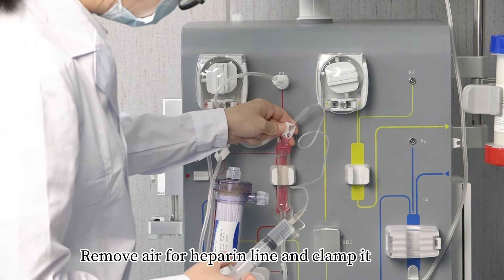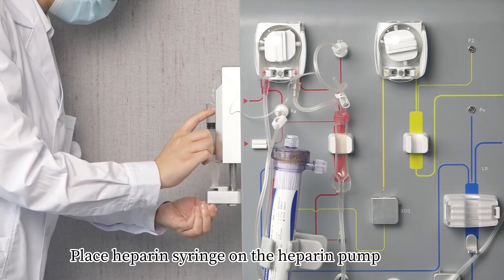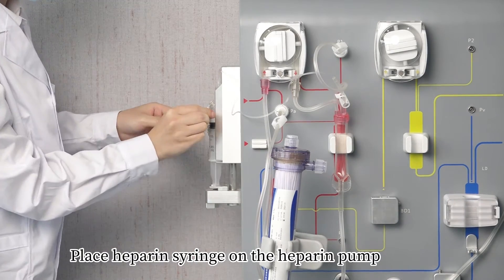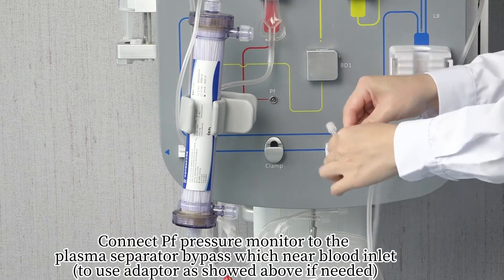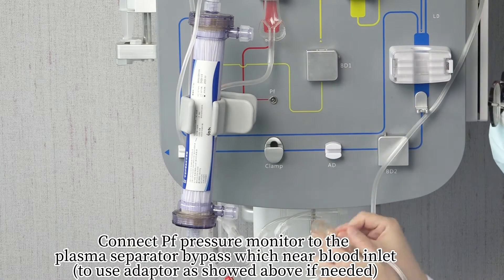Connect the syringe with heparin to the heparin line if under heparin anticoagulation. Remove air from the heparin line and clamp it. Place the heparin syringe on the heparin pump. Connect the PF pressure monitor to the plasma separator bypass near the blood inlet.